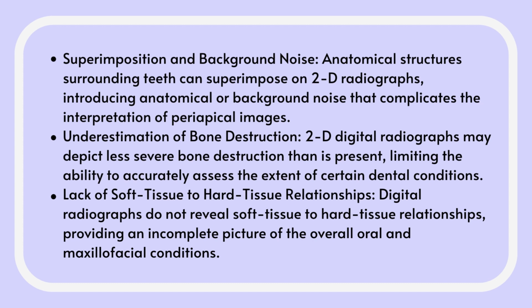Underestimation of bone destruction. 2D digital radiographs may depict less severe bone destruction than is present, limiting the ability to accurately assess the extent of certain dental conditions. Lack of soft tissue to hard tissue relationship. Digital radiographs do not reveal the soft tissue to hard tissue relationship, providing an incomplete picture of the overall oral and maxillofacial conditions.